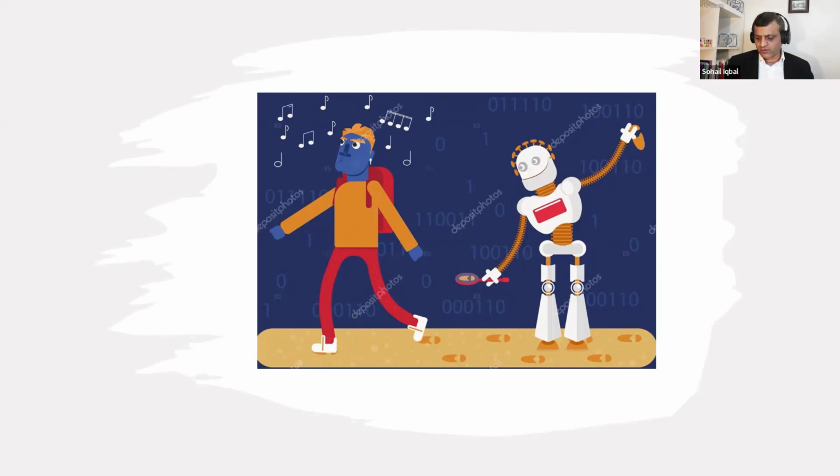In Python and MATLAB, there are commands which can compute the connected components. So then you probably get a set that's disconnected. Yes, of course. That's the point. At each and every region, in each and every block, we want to see which are the connected components which are important features.